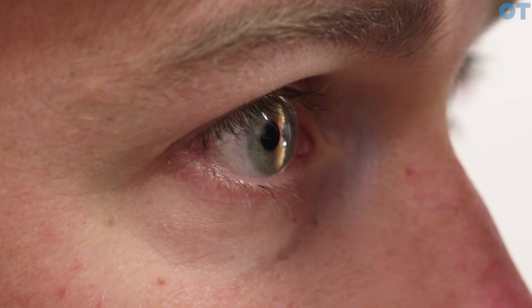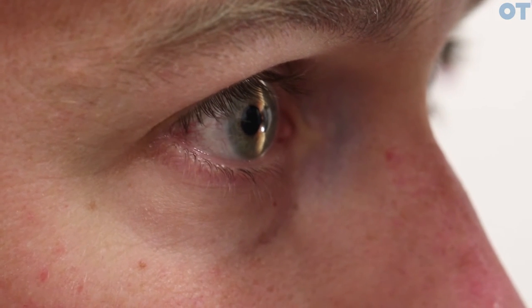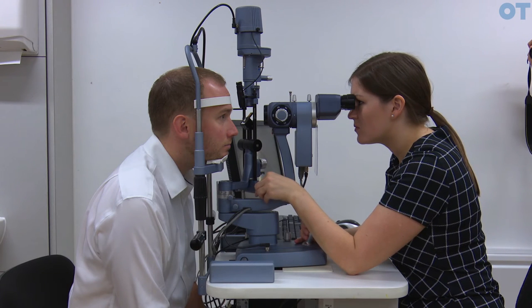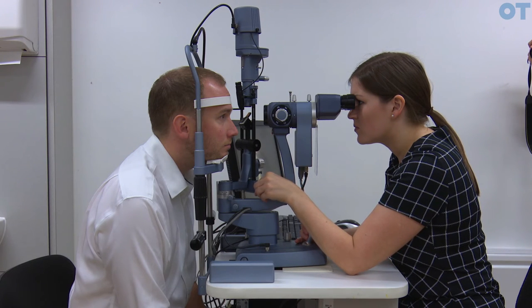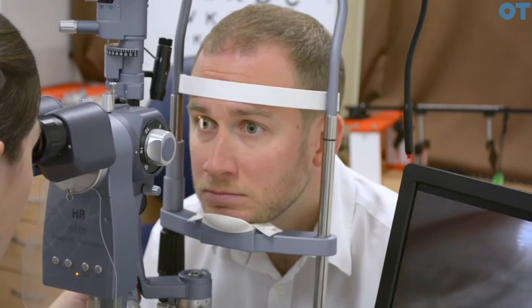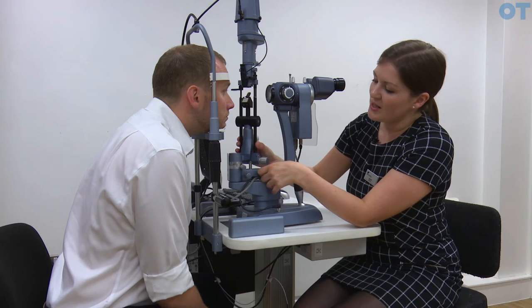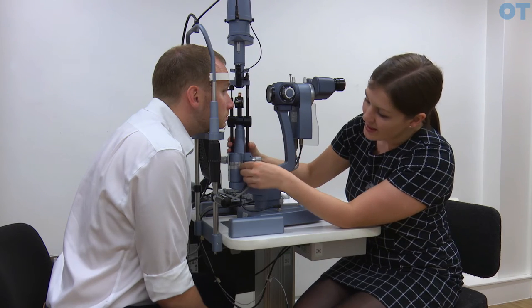The narrower the chamber is, the less likely you are to dilate the pupil, so it is important if someone's anterior chamber angle is narrow that you check it both temporally and nasally. You have to be careful of the nose when measuring nasally — always check before you swing the illumination system round that you are not going to hit the patient's nose. Again, you are locking it at 60 degrees and placing the beam at the limbus.